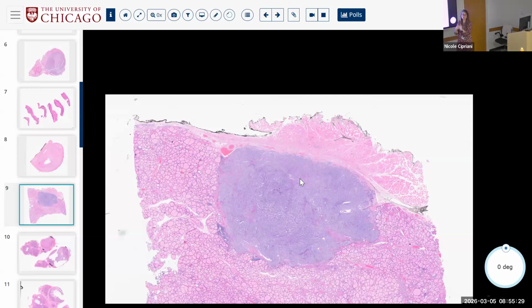So there have been some circumstances where we've said there's desmoplastic adherence of tumor to muscle, but I don't see overt invasion of muscle, therefore I can't upstage it. But normally, if it's in the muscle and they took it, I would just upstage it. If it's in the fat only, that doesn't upstage it.